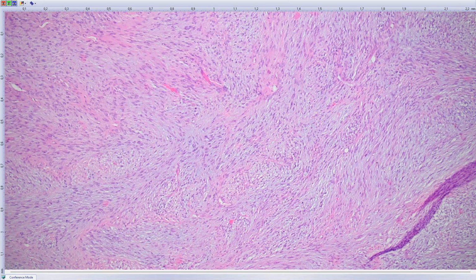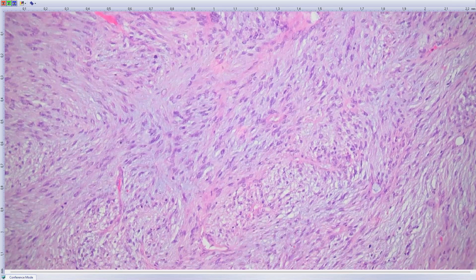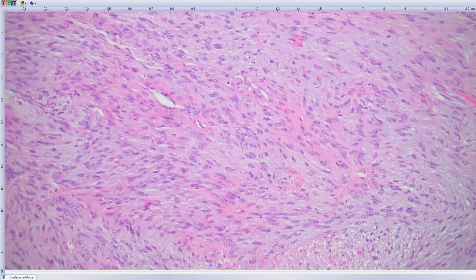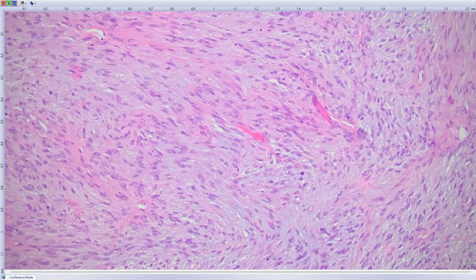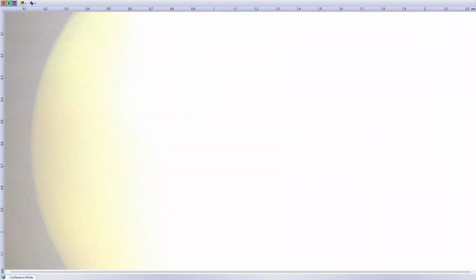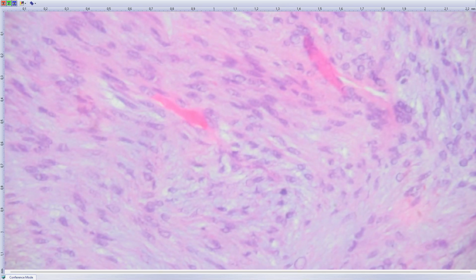So with this variable cellularity, this fascicular growth pattern, a little bit of myxoid looking stroma. Not that big atypia, but these cells are definitely atypical. And the most important finding here is that we've got plenty of mitotic figures, really many. It's difficult to show them on the scan on a camera, but maybe here in the middle, there are really many mitotic figures.